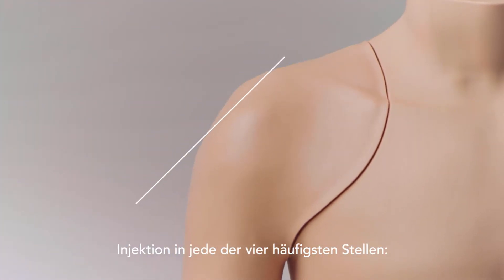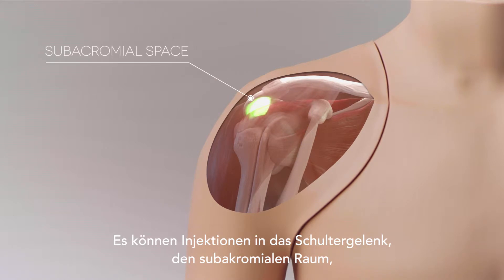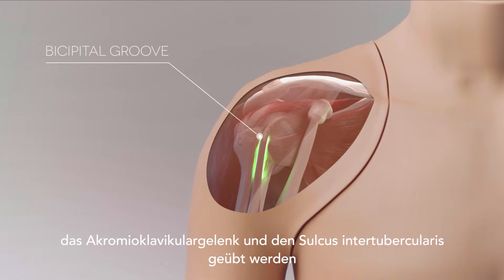Injection into each of the four most common sites — the glenohumeral joint, subacromial space, acromioclavicular joint, and bicipital groove — can be practiced.